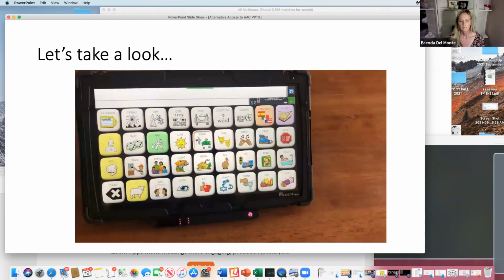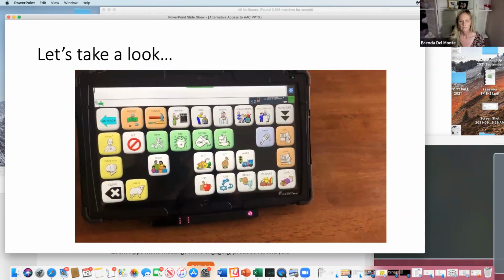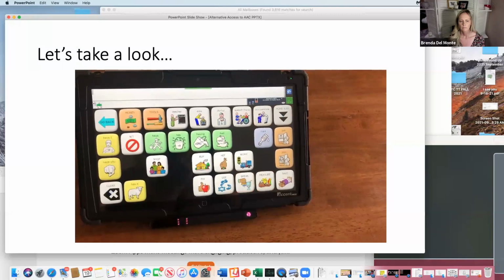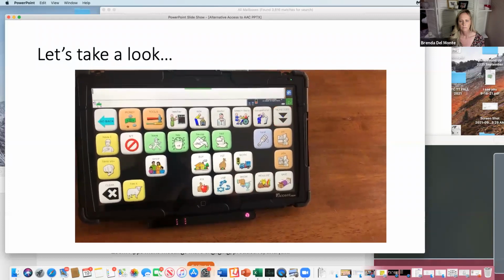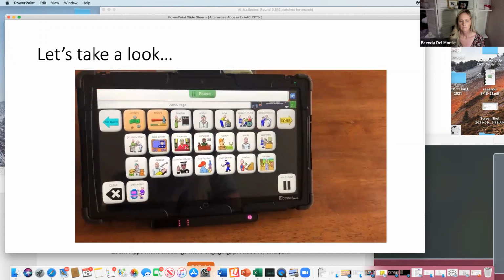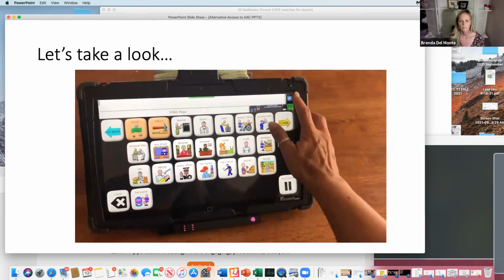I have a highlight on, I have a shrinking dot on. There are a few other things you can change to make your cursor on the screen highlighted or not. So that is just a brief overview of the Accent.